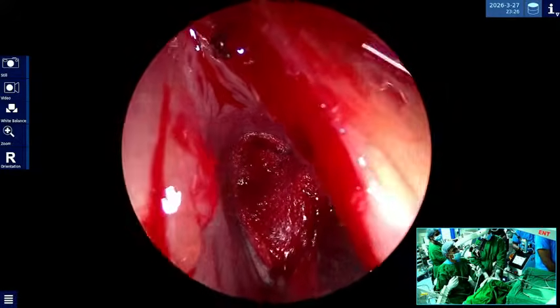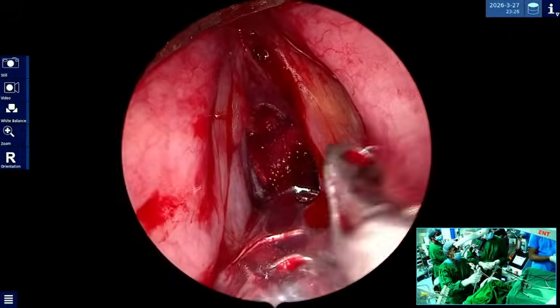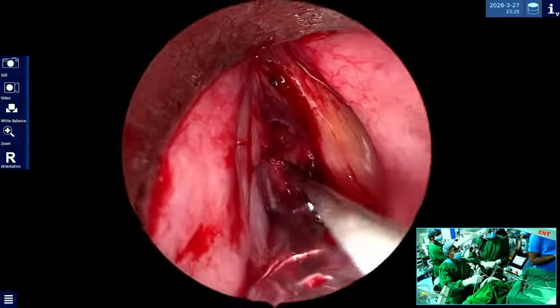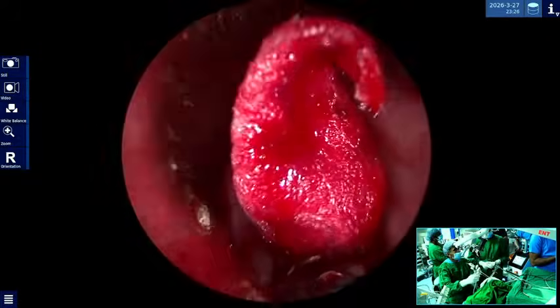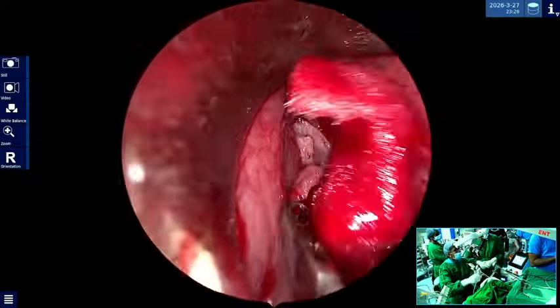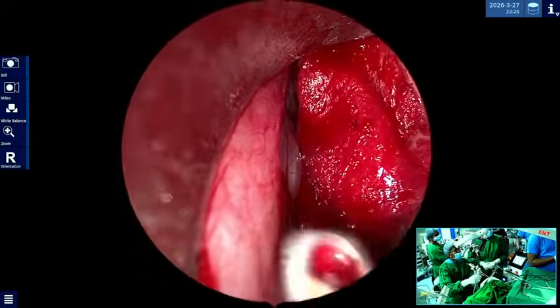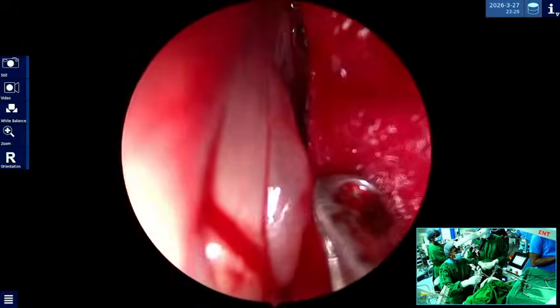And this is this. So approaching in this area, it was a bit tough. The laser light was not reaching properly, and your instrument also. So the right side that lesion was done, and probably this looks like more of a contact lesion.